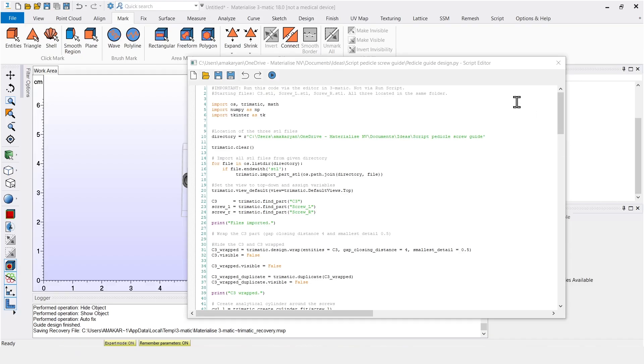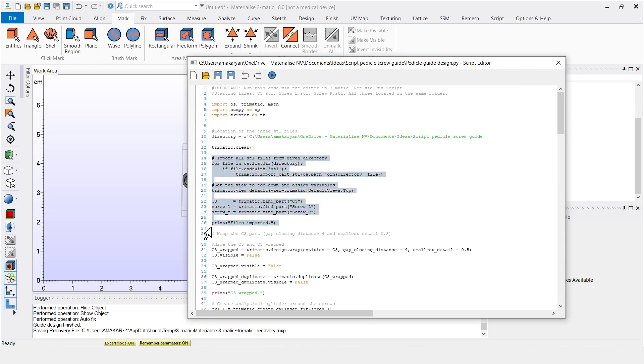Let's take a look at the code without diving into too much detail. I wrote some comments here and there to make the code more readable for myself and others. So here we import the vertebra and the two screws.